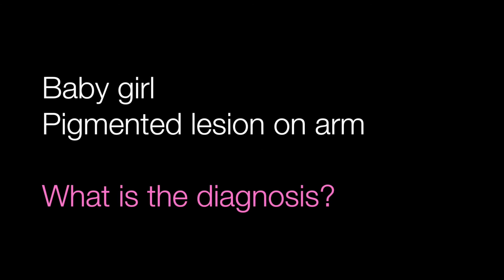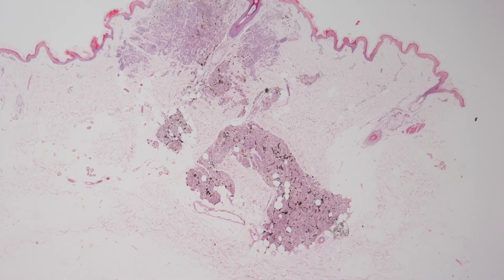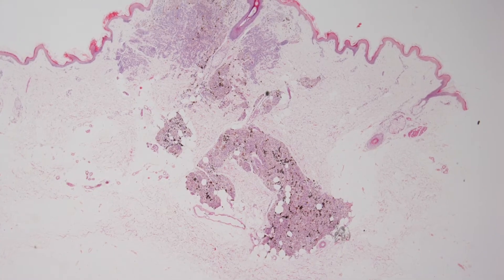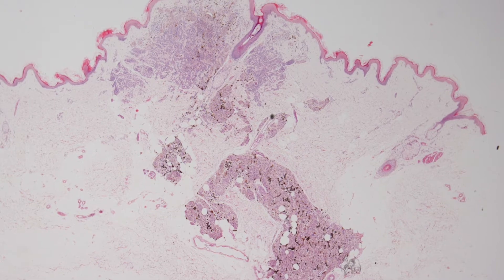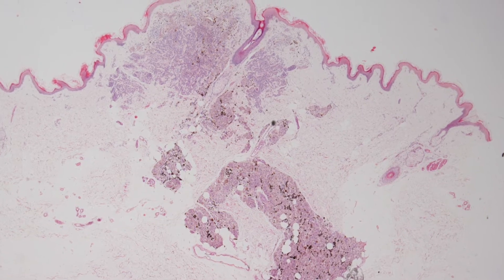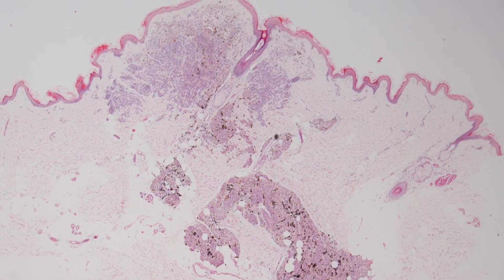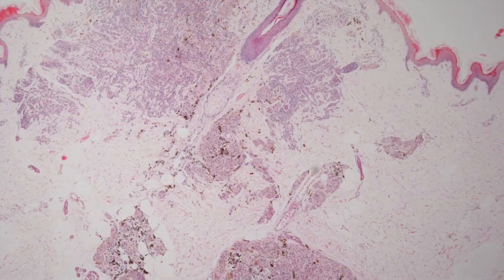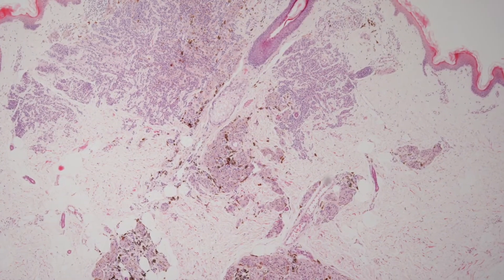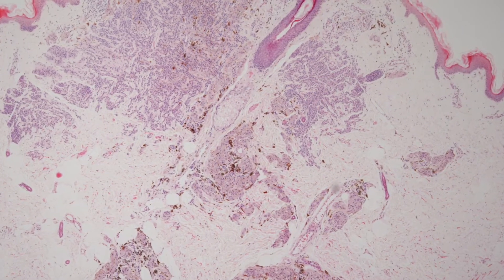Case number three is a pigmented lesion on the arm from a baby girl. What is the diagnosis? Here is a low power view and here are some higher power views of the lesion.